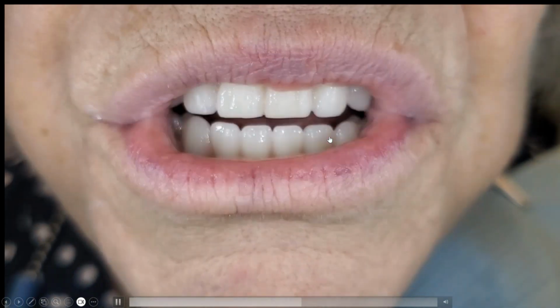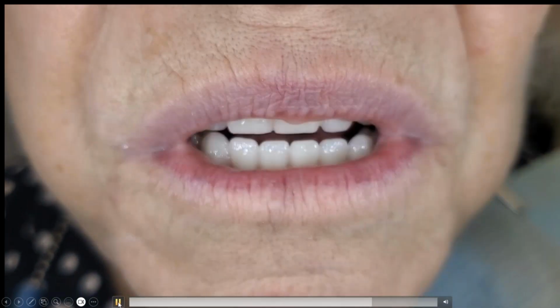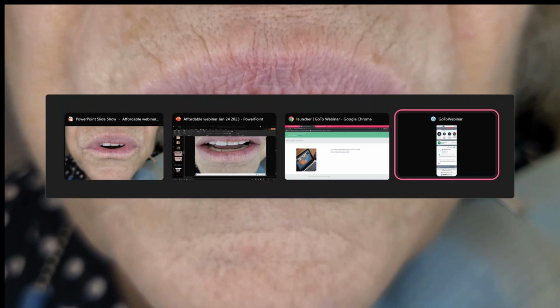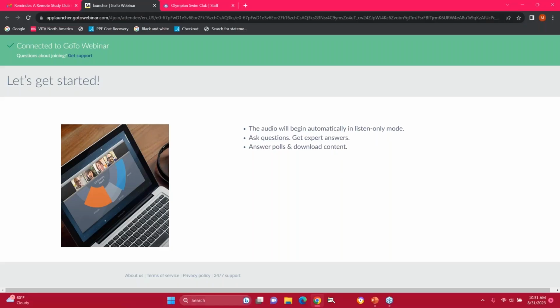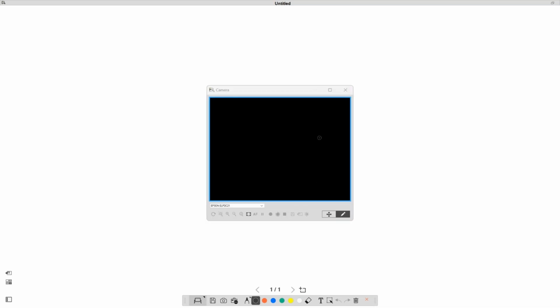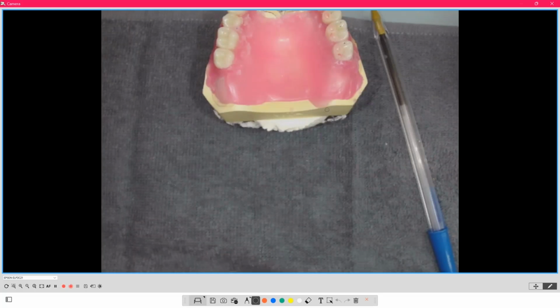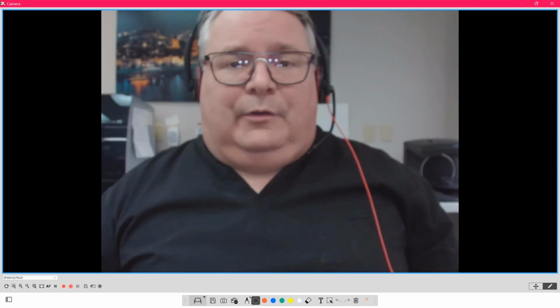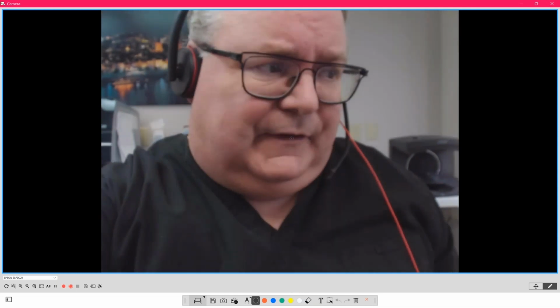So now when I say respectfully, it's in the wrong position, now you can take that back to the doctor and say, okay, we need to move the tooth into a different position, which could require a complete 6 anterior reset or 12 anterior reset. Yeah, but we got to stop this from getting any worse or breaking, or maybe I can just reset that one tooth a little bit forward without it looking odd in the setup.